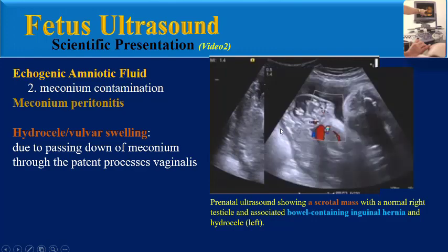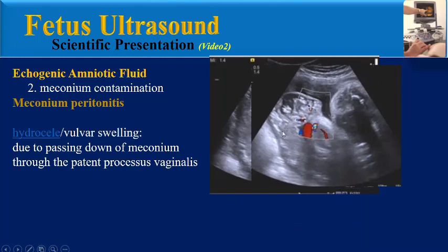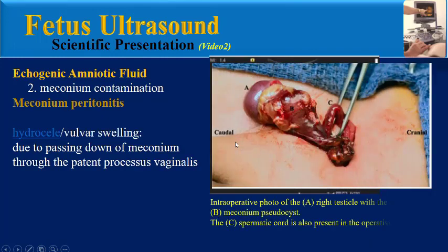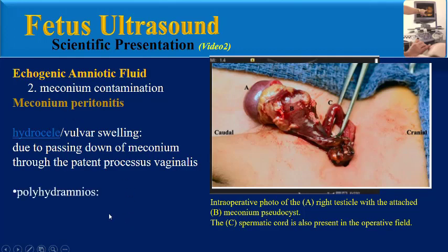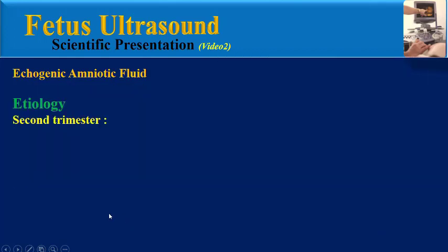On color Doppler there is no flow in the mass. An intraoperative photo shows a meconium pseudocyst attached to the upper pole of the testicle. The last finding of meconium peritonitis is polyhydramnios.